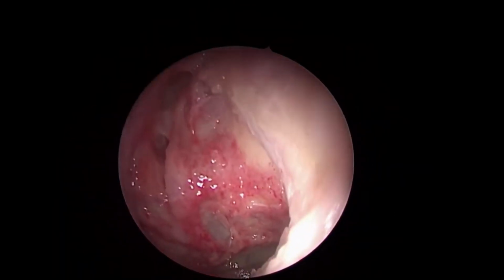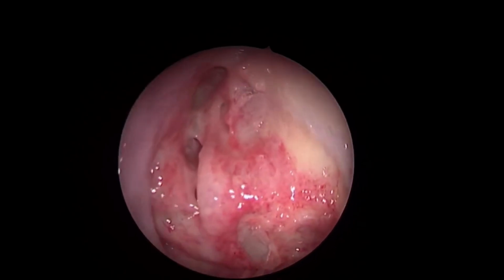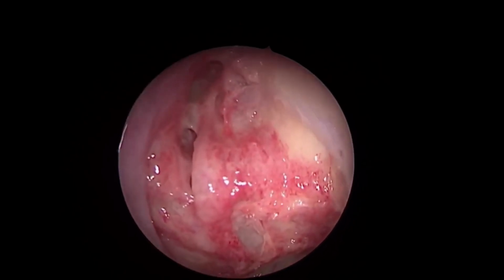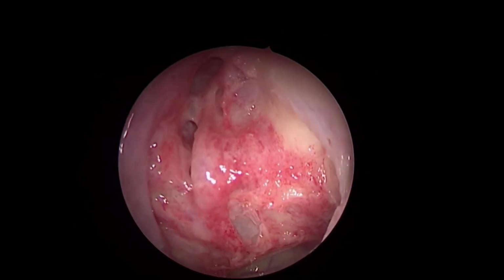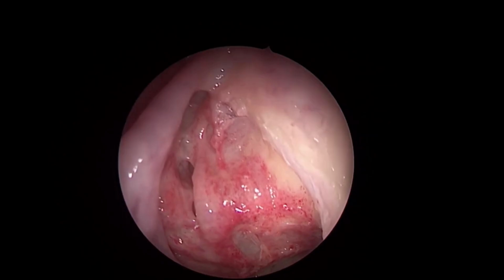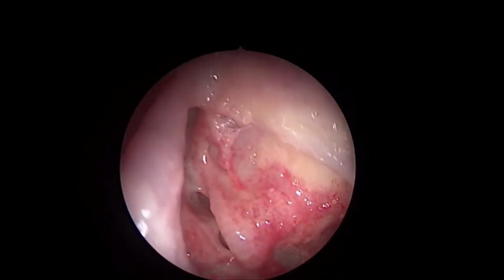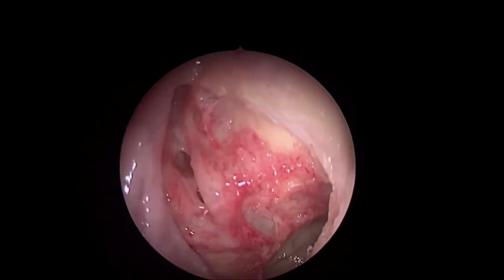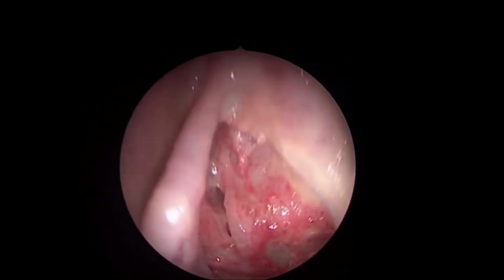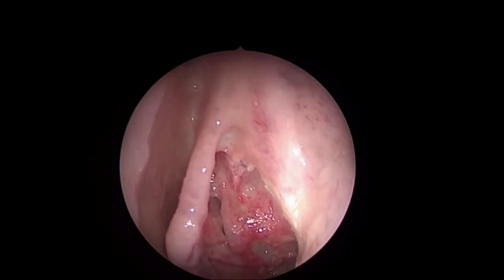And this is considered to be one of the most challenging areas for the sinus surgeon to understand: the frontal sinus anatomy and dissection and surgery onto the frontal sinus. For that reason, we need to understand certain anatomy. Number one, see why we are so frightened with the frontal sinus work. We are frightened because of certain possibility of complications.